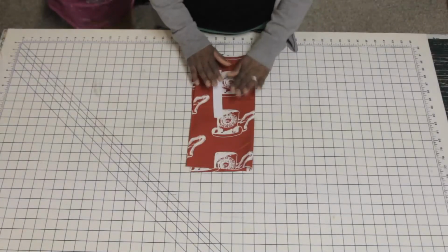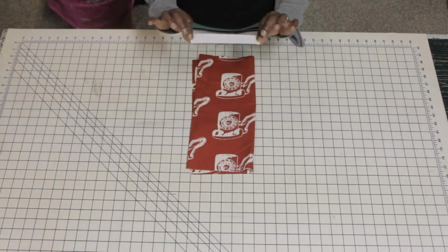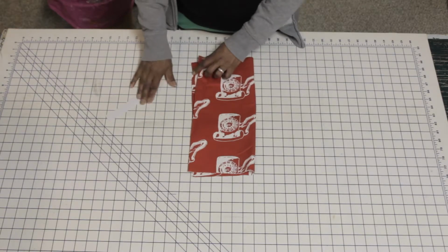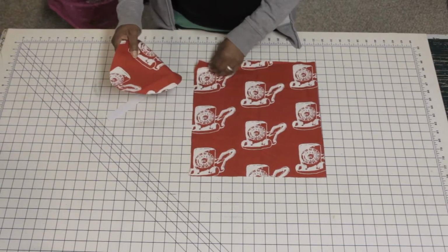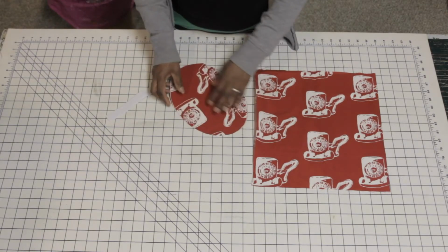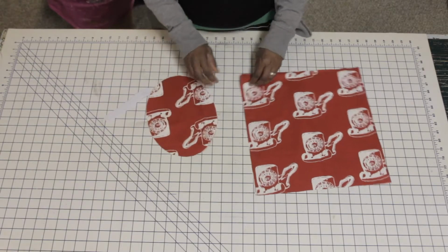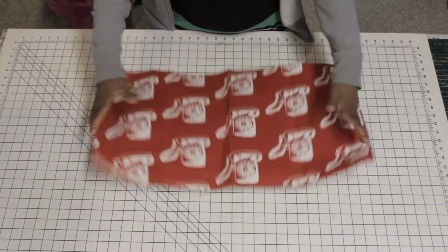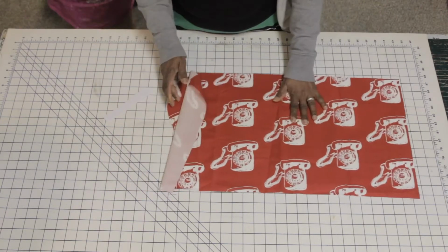So we have our kit here for the scrub caps that we're going to be making. First of all, you have your 5.5 inch piece of elastic that's already been cut for you in the package, as well as the pieces for your scrub cap. There are 2 pieces of oval. They're actually already facing each other, wrong sides facing, and you have your one large piece that's going to be your main part of your cap.